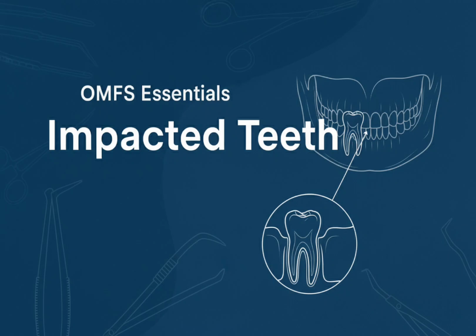The lingual nerve lies supraperiosteally. Reflecting the flap in the subperiosteal plane tight to the bone safely reflects the nerve with the flap. 2. It allows safe removal of the distal lingual lock of bone that often prevents tooth elevation.